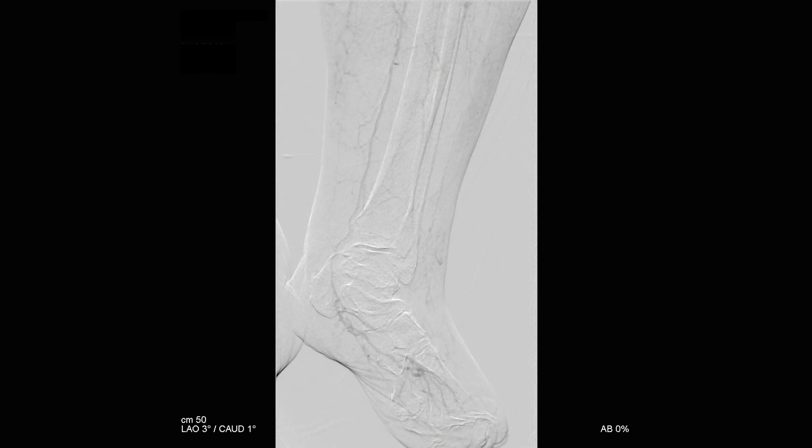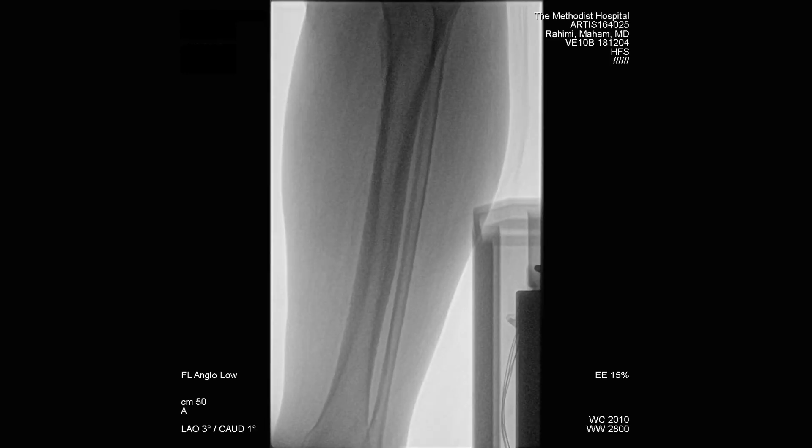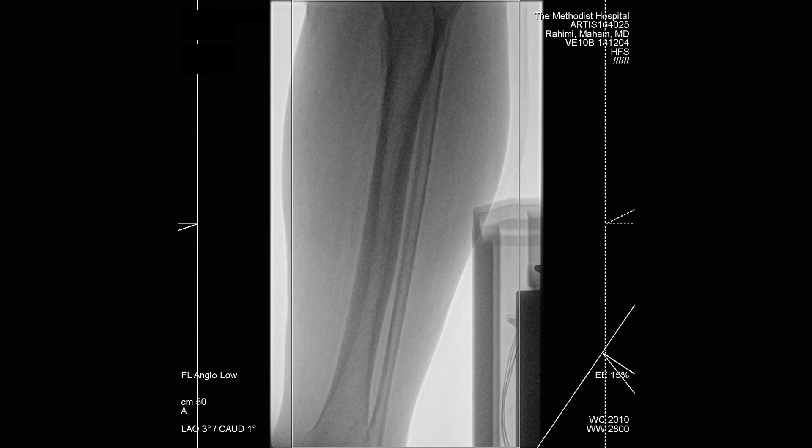This patient was ultimately found to have long-segment occlusion of the SFA and popliteal arteries, an occluded peroneal artery, and an occluded anterior tibial artery. The posterior tibial artery was found to reconstitute distally without any direct inline flow, through collaterals from the profunda femoris artery.